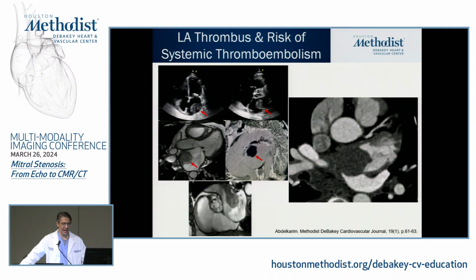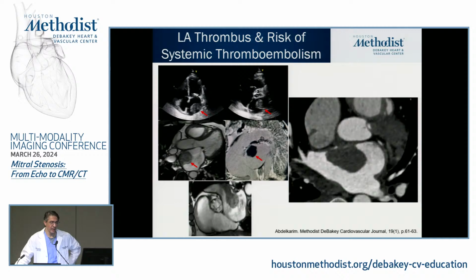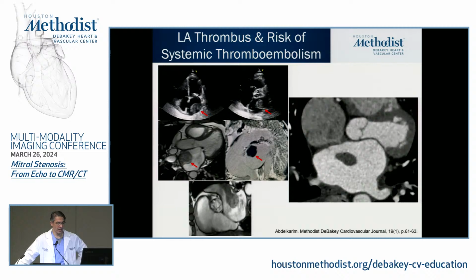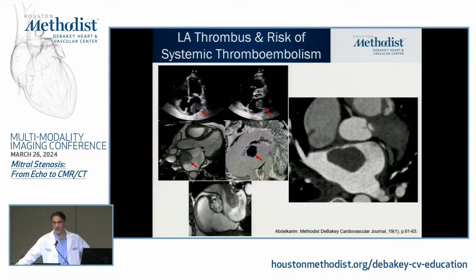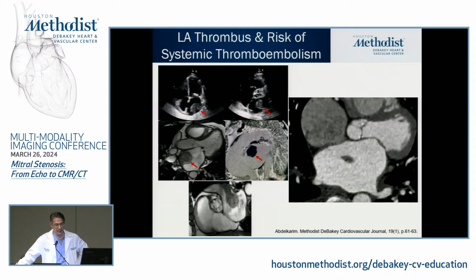But I think one place we have a strong strength, at least for the atrium, is to rule out LA thrombus. And we know patients who have mitral stenosis can have a lot of stagnant blood in the left atrium, and they are at risk for developing thrombosis, especially if they have concomitant atrial fibrillation. So this is a case where on the top slices you can see this large mass in the left atrium on echo. CMR can be very helpful in the setting of thrombus because it can be very definitive, using tissue characteristics to tell you that there's no LGE uptake, which by definition is the definition of a chronic thrombus. And that's what you see by this very dense black in the bottom right. And that's the thrombus not taking up any contrast.